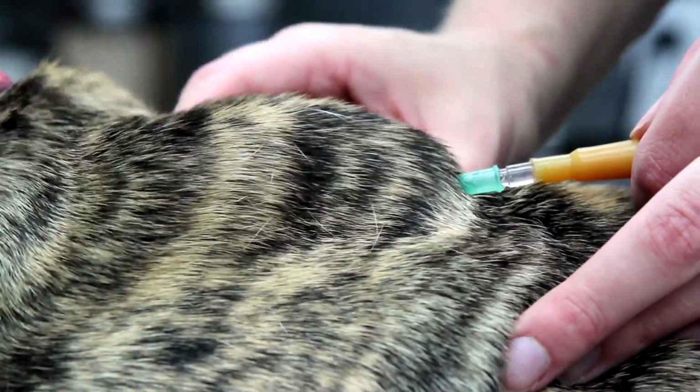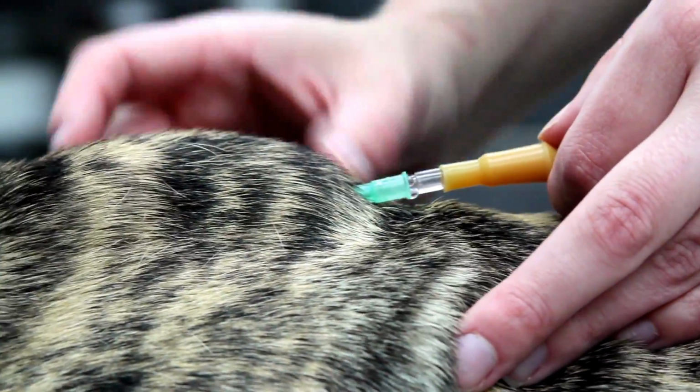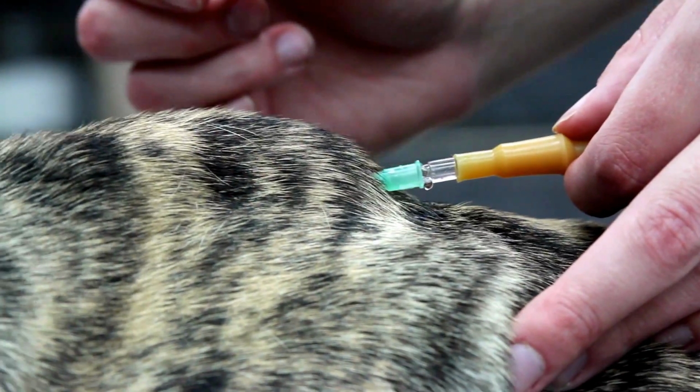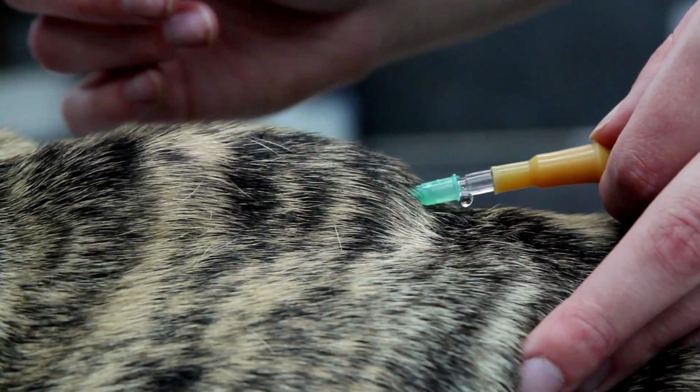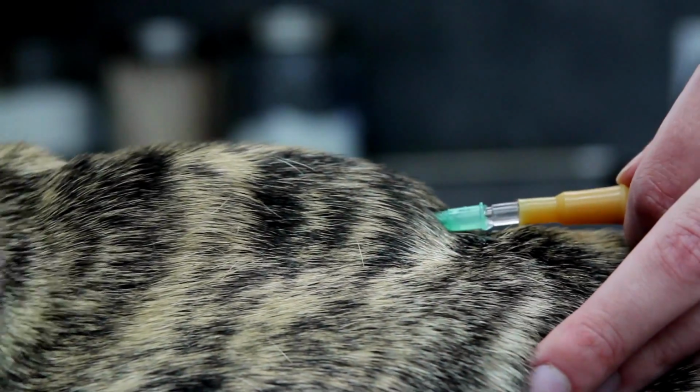Again, just keeping a hold of the needle, and as you see, the little bleb is getting bigger and bigger here the more fluids that we give. This is what's going to give your pet the fluids, and they're going to be absorbed over the next couple hours or so to keep them hydrated.